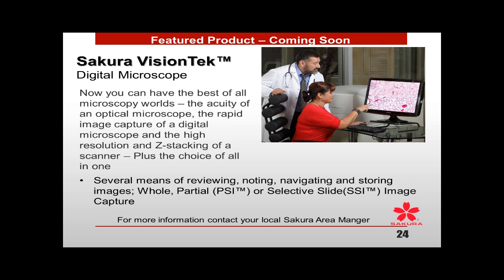The average time for scans can vary. Most vendors will tell you they can take a 15 by 15 millimeter area in a couple of minutes. If you have a whole piece of tumor that takes up over half of your glass slide, just keep adding time to it.